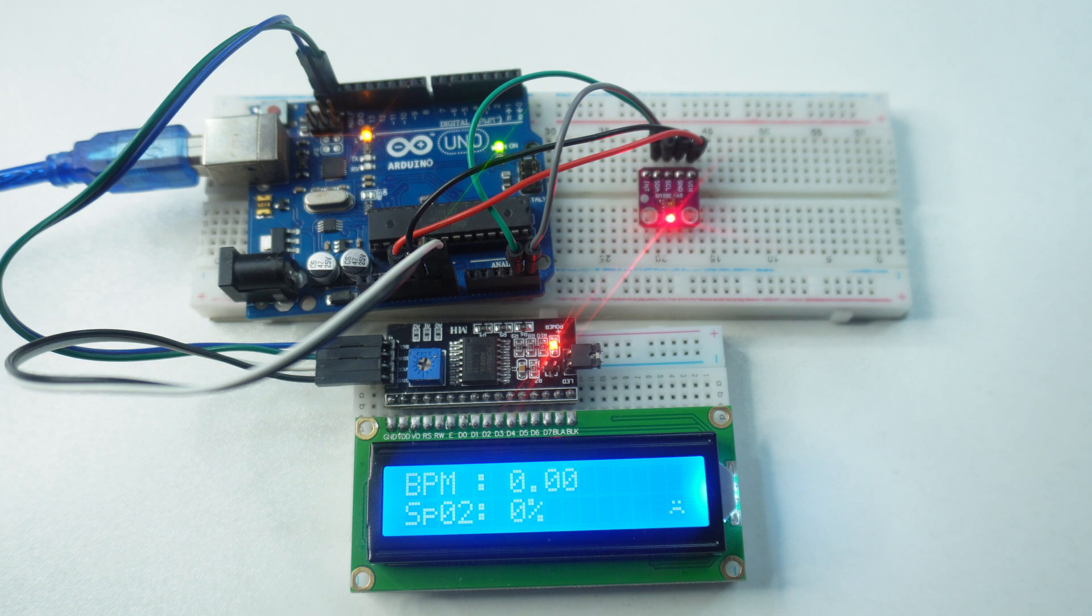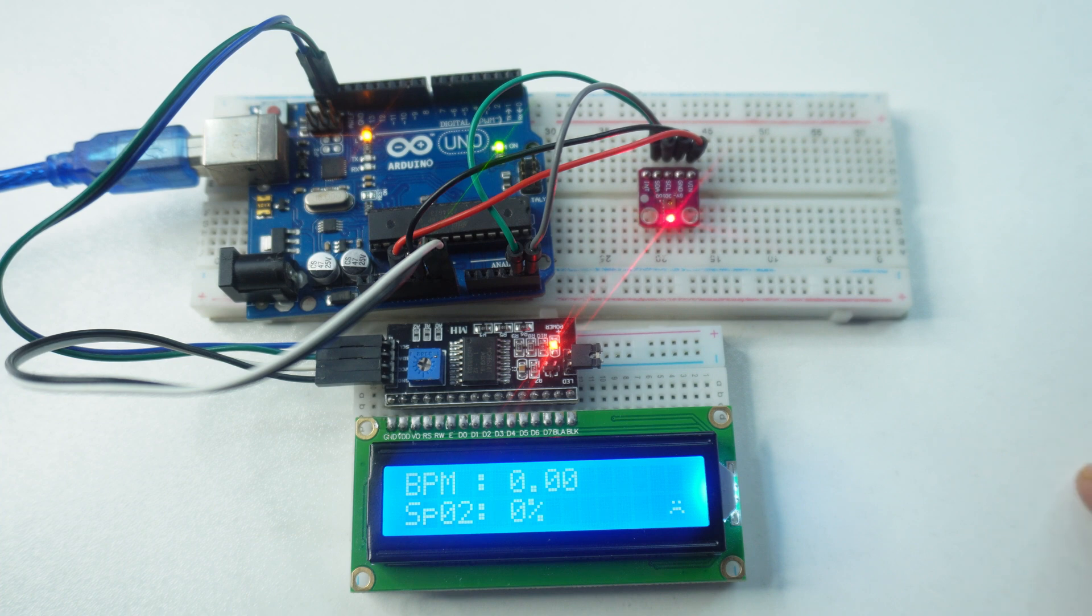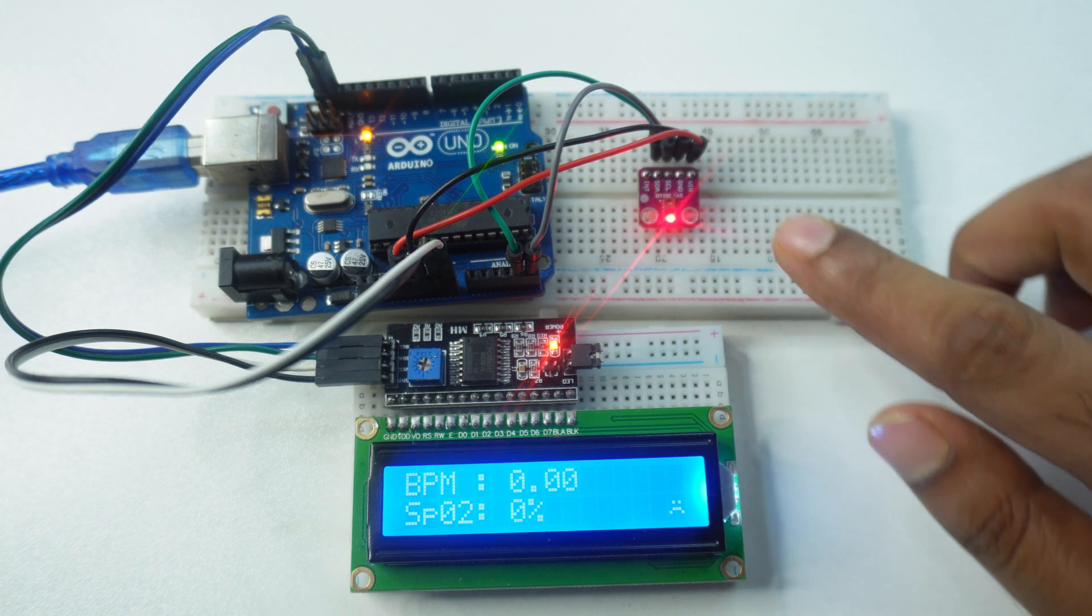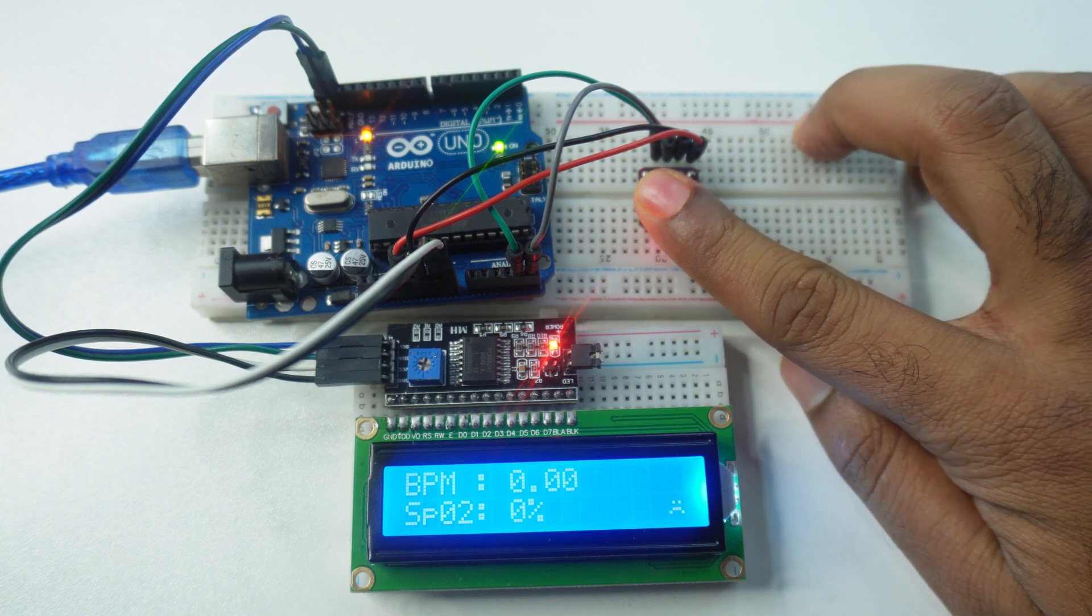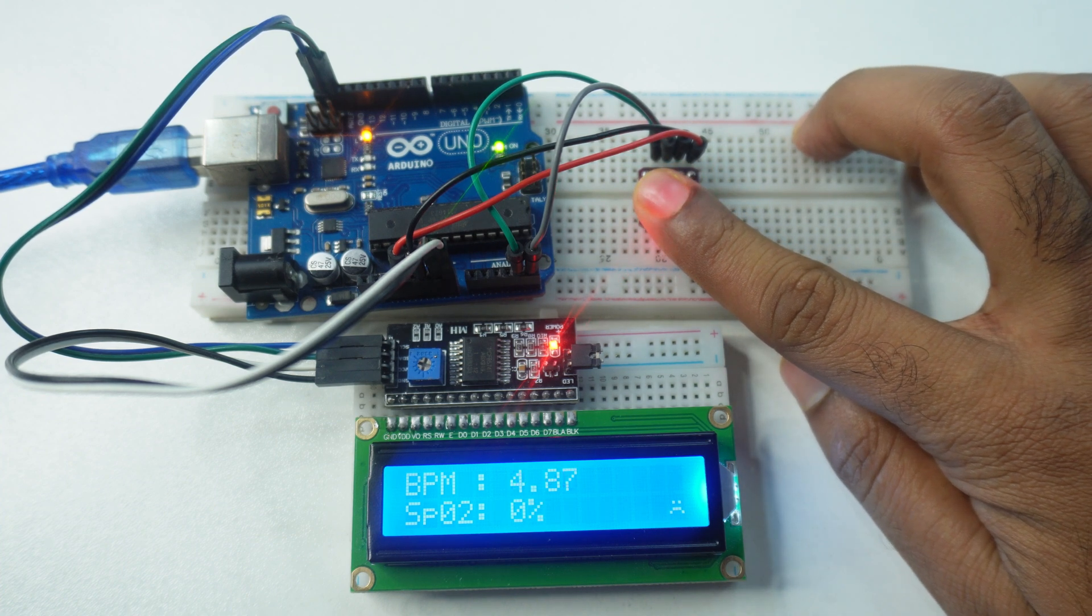Okay, our project is now working fine. To measure the heartbeat and oxygen level in blood, just put your finger on the sensor. It will display the data on display.